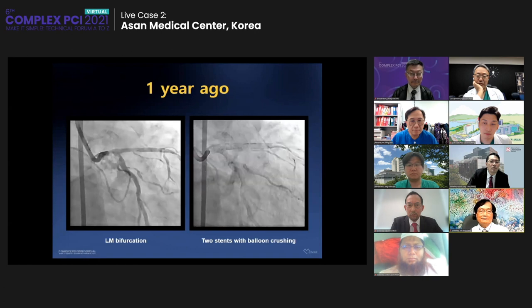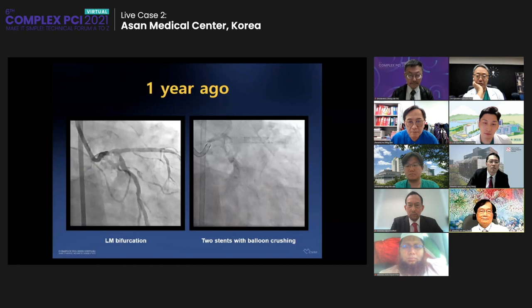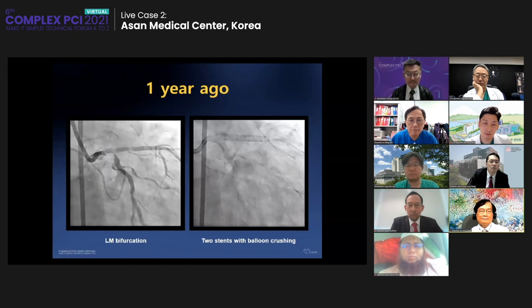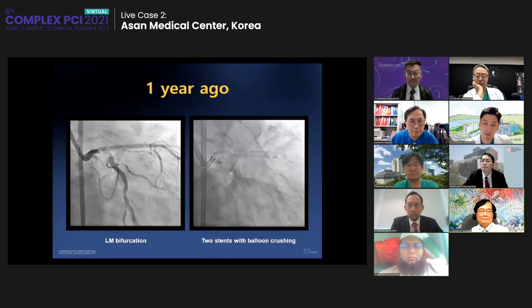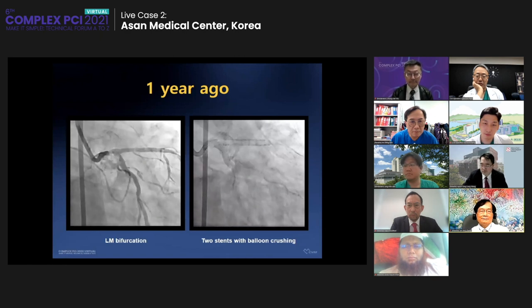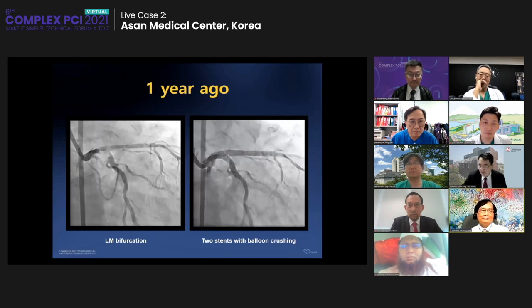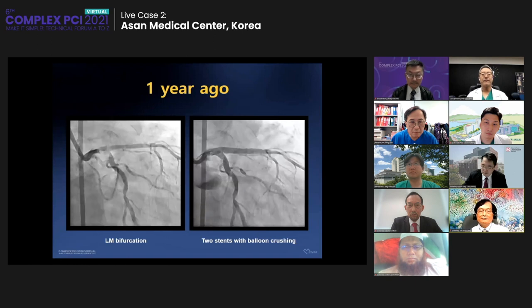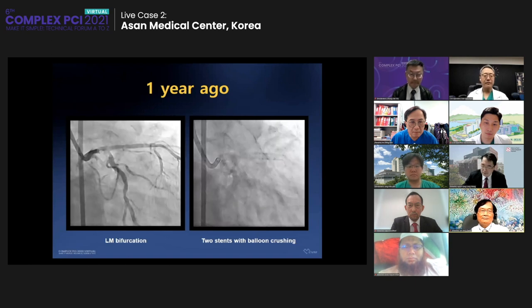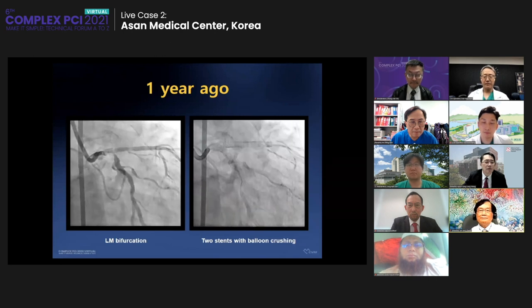This is one year ago. We did a two-stent technique with a balloon crush. The final result was very excellent. And this slide is the last slide. If I summarize this patient's background briefly, he is a 66-year-old male, of relatively intermediate age. This patient also underwent a mid-LAD stent. What kind of stent in 2008? There was no information, as it was from another hospital. And when did he undergo the RCA stent? One year ago.